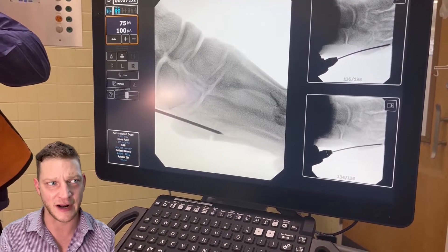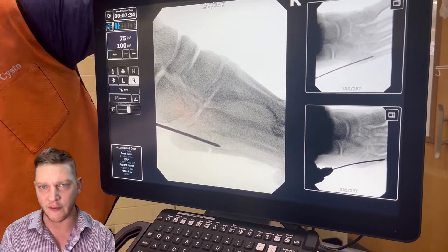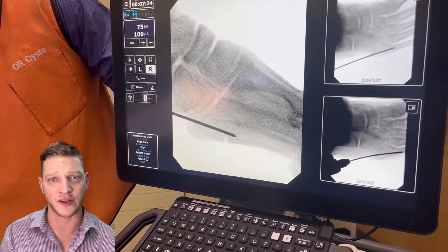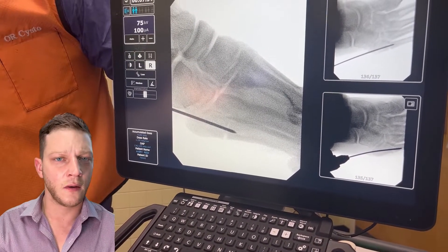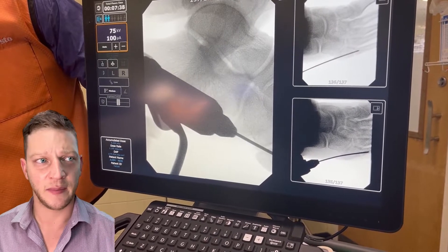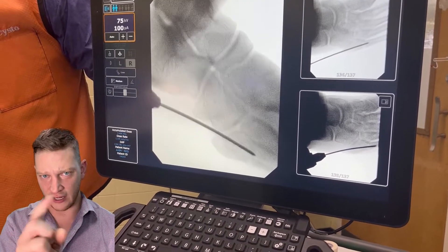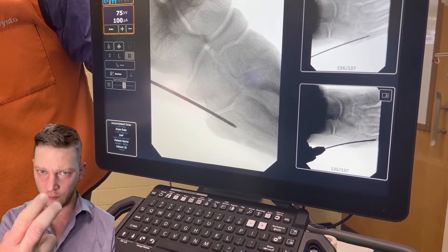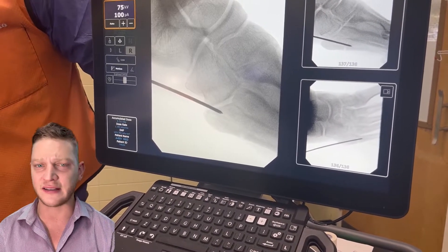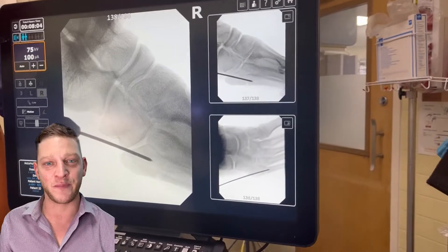Checking the lateral — come on, please... I think that might be it. Let's push it a little further forward and see what happens. We need it all the way down the medulla of the bone — the center of the bone is where you want that screw. About five or six tries is average for this. Sometimes you oscillate the K-wire: one trigger spins clockwise, the other counterclockwise, pressing both oscillates it, which helps it not grab soft tissue as you send it deep. We got it — there we go!